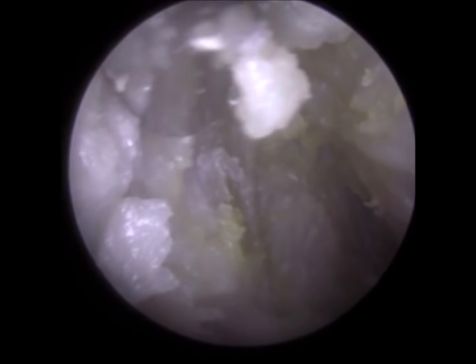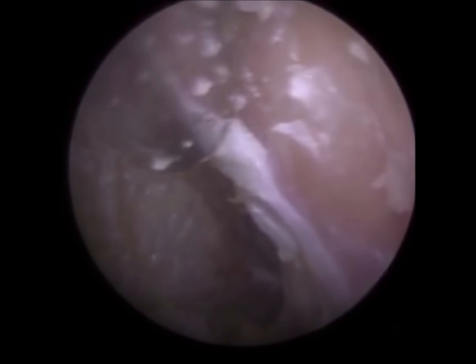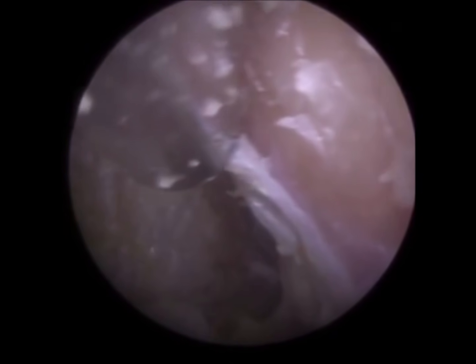So we'll just continue to work away with this dead keratin. Patience is a virtue. There's no shortcuts with some procedures. Okay, I'm just trying to remove as much dead keratin as I can, because whilst this keratin's in the ear, it's infected. It's going to die, it's going to get infected, and it's going to cause more erosion. So it's just not possible we can get every single bit of keratin out today. It would be there for several hours. But just trying to remove as much as I can and as safely as I can.